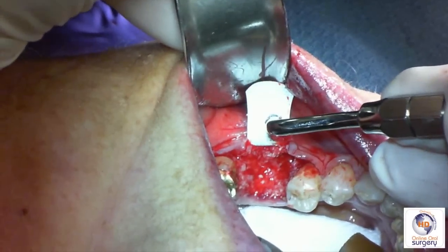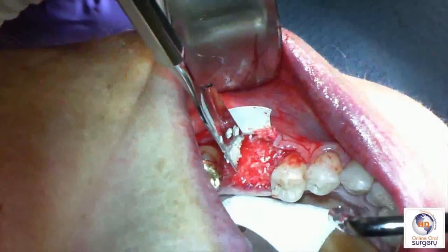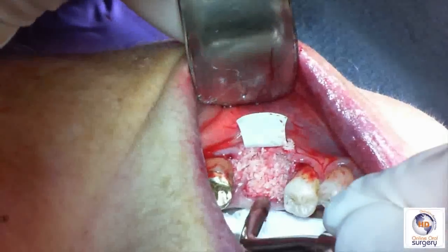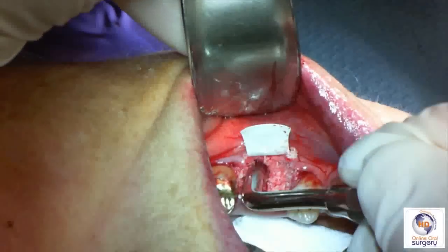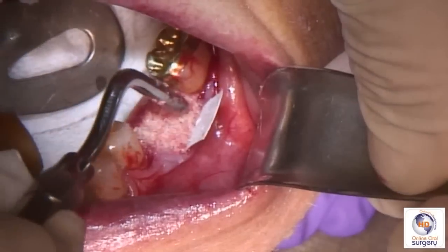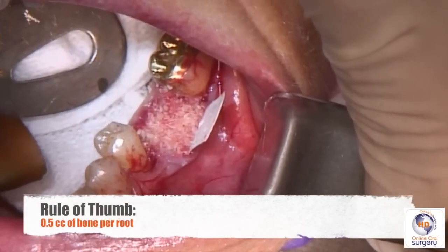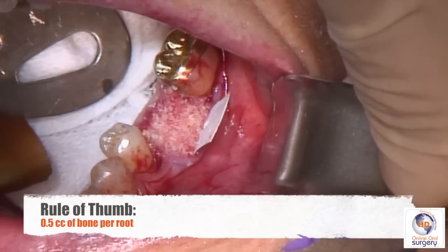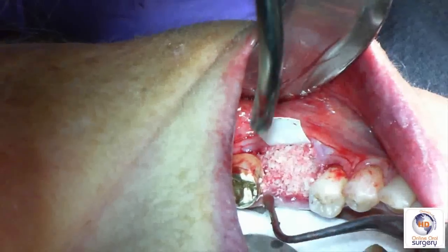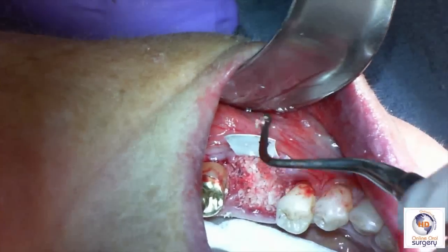It takes a little bit of practice to learn exactly how firm to pack it, but it's a pretty short learning curve. We blot the graft periodically to remove excess blood or fluid so that we can condense it nicely. As a general rule, you're going to use about a half a cc of bone per root. So for a molar, which has two roots, you'll use one cc of bone as a good rule of thumb. The same holds true for maxillary molars, and anterior teeth and premolars generally require about a half a cc of bone since they have a single root.